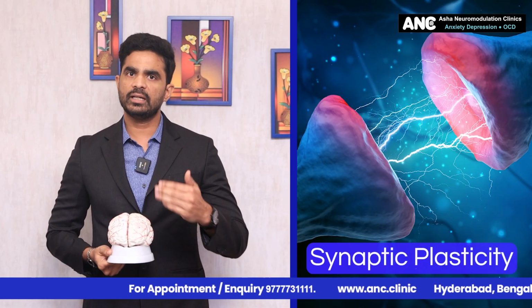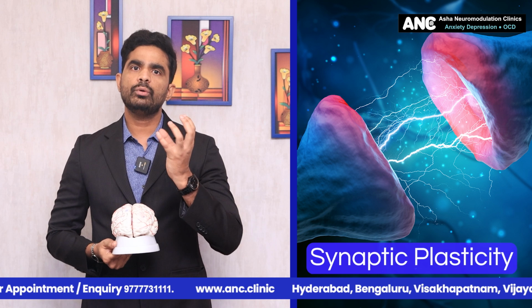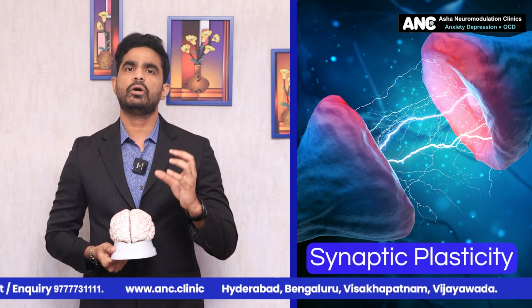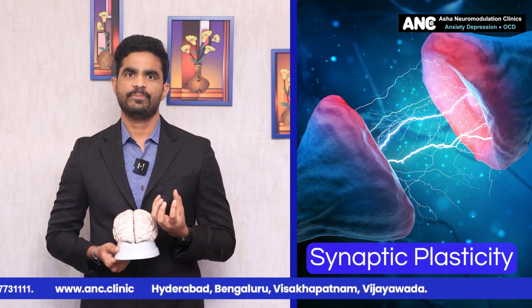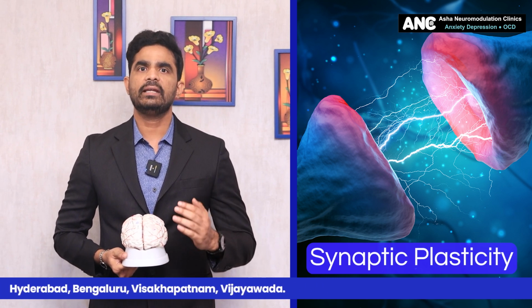If I do it over a number of sessions, eventually the neurons tend to modify their function and modify their structure also. Okay, this beautiful mechanism is called synaptic plasticity. Repeated exposures of the neurons to this electric field will automatically produce some plastic changes in that area, which are long-term effects.